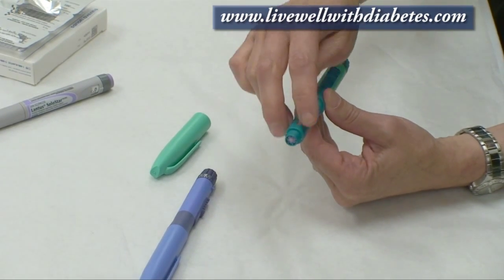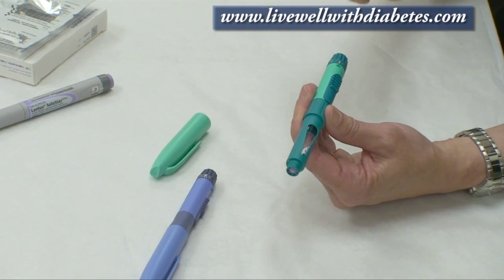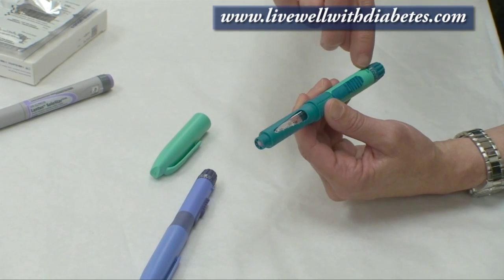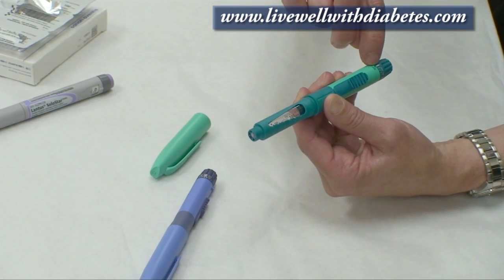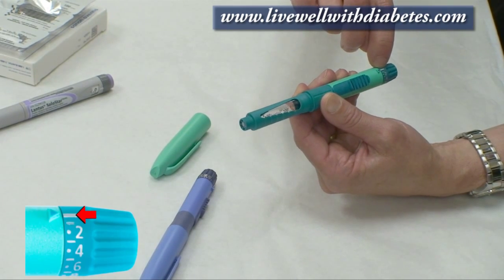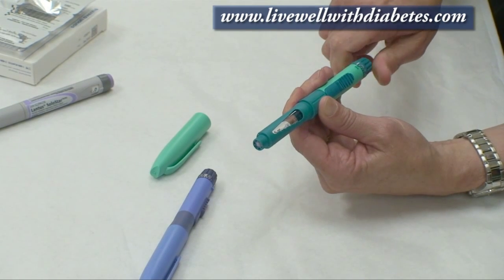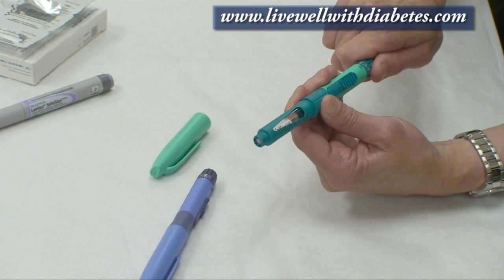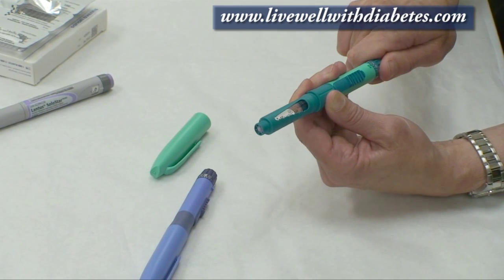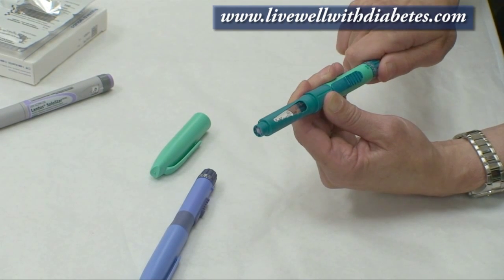Each glass cartridge of insulin holds 300 units. On this end is the dial, and where the triangle is next to the solid line is at zero. When I turn the dose, the first click is one unit, the next click is a second unit — it's very easy to hear and feel the clicks; that's how you change the dose.